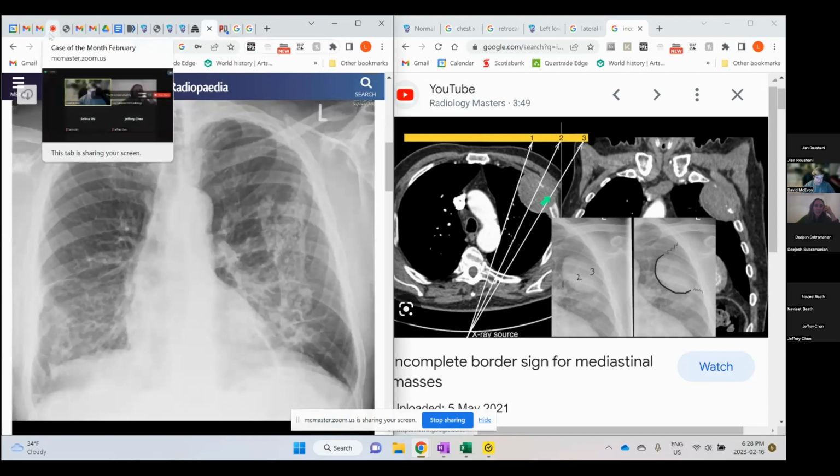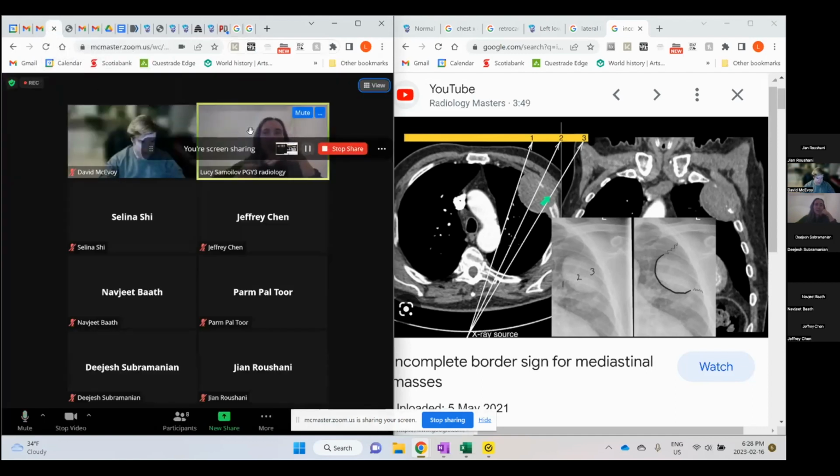Anyways, I also suspect they might have ordered the CT because the presence of plaques like this implies that somebody had asbestos exposure, which significantly increases your risk of not just mesothelioma, but also lung cancer. So maybe they were looking for suspicious features, like I mentioned, circumferential thickening, volume loss or abnormal nodularity.